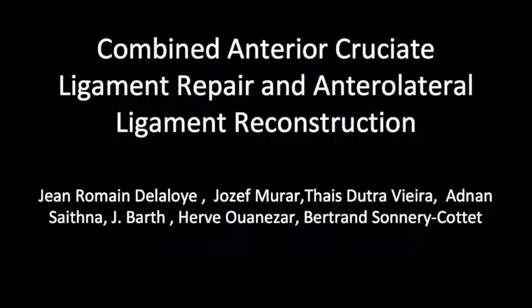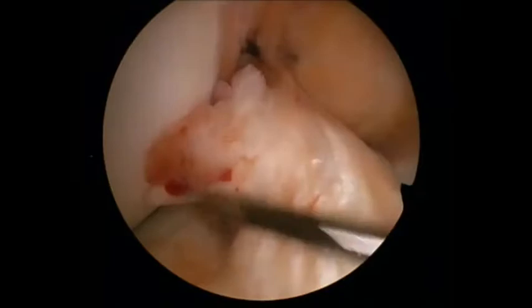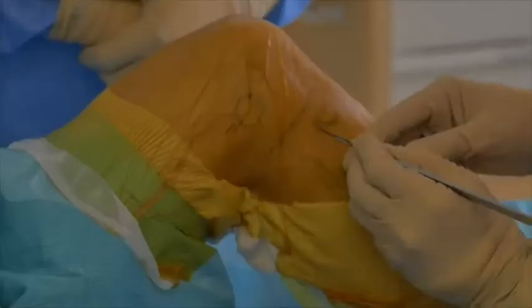This video demonstrates a new technique for primary ACL repair with a combined anterolateral ligament reconstruction. First, the ACL remnant is evaluated for repair possibility.